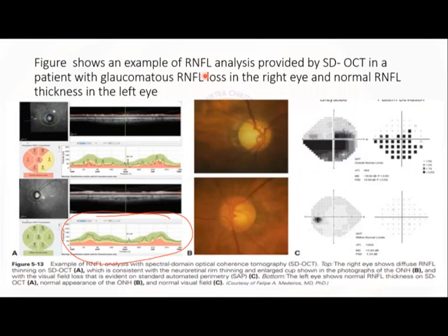And if you see here in the right upper part, which eye is it? The right eye, sir. That also has a lot of fluctuations. If you have a gross thinning of the neuroretinal rim and RNFL, it will have some flat line or it will follow some double hump pattern in the red zone. But here it is more of a fluttering kind of thing. So this also should be looked for. It should follow a double hump pattern.